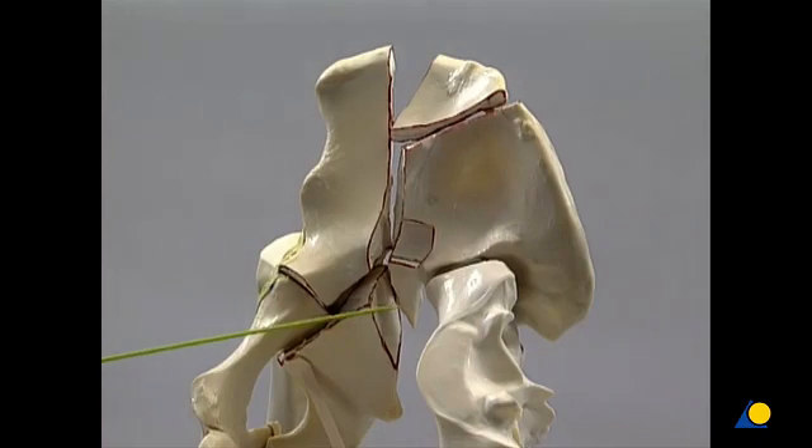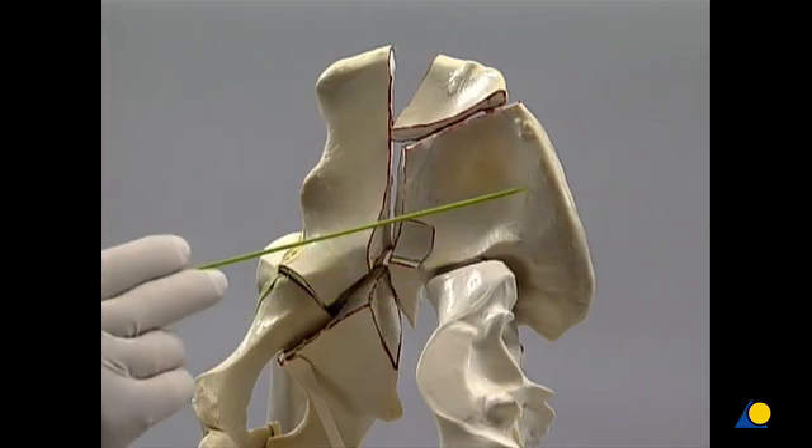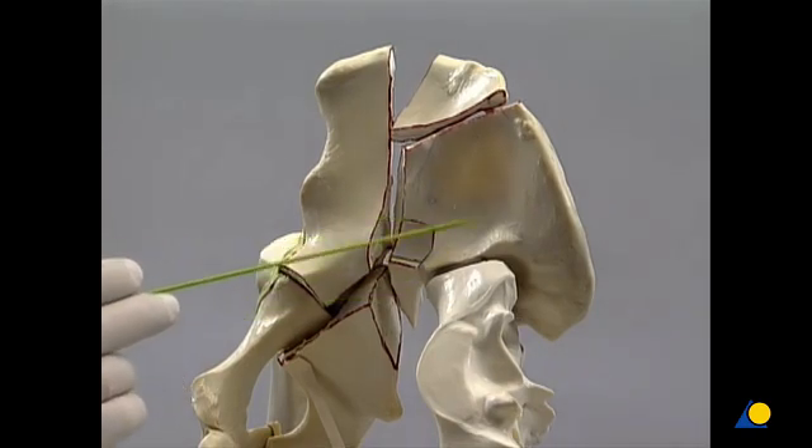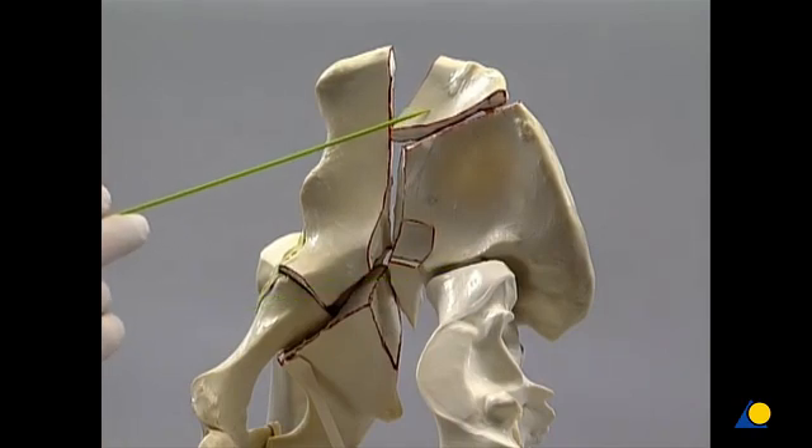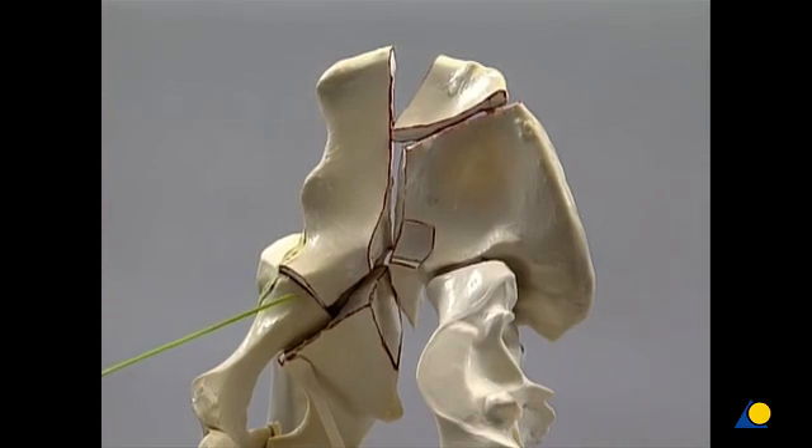When viewed from the internal aspect, the sacroiliac joint and the iliac wing fragment that remains attached to the sacrum can be seen. This is the large free fragment, and this is the anterior column component with the acetabular dome. Part of the anterior column with the superior pubis ramus can be seen as well. The femoral head is visible, or at least palpable, through the fracture of the quadrilateral surface.